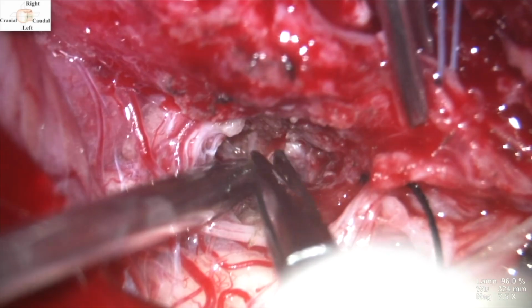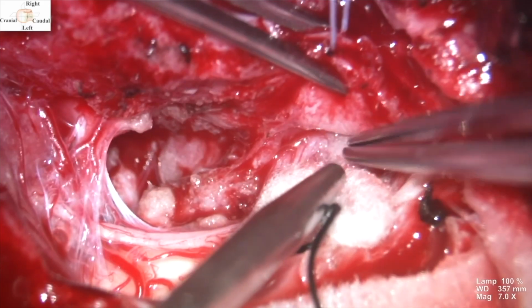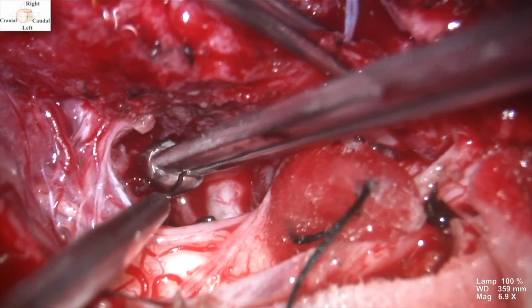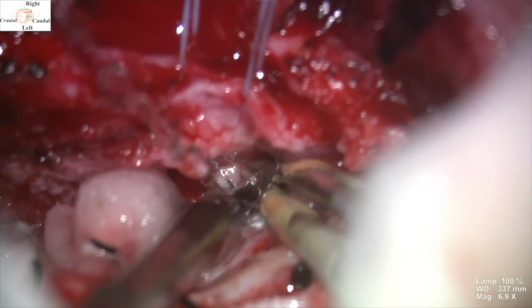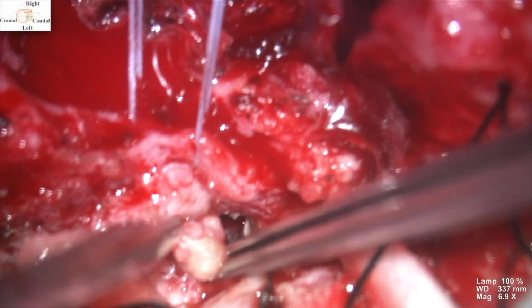After adequate debulking through the corridors between the C1 and C2 dorsal nerve roots, the inferior aspect of the tumor was accessed and gently teased away from the spinal cord and the surrounding structures. The lateral and ventrolateral dural attachment of the tumor were then coagulated and the lesion was decompressed and removed in a piecemeal fashion, maintaining dissection within safe anatomical planes.